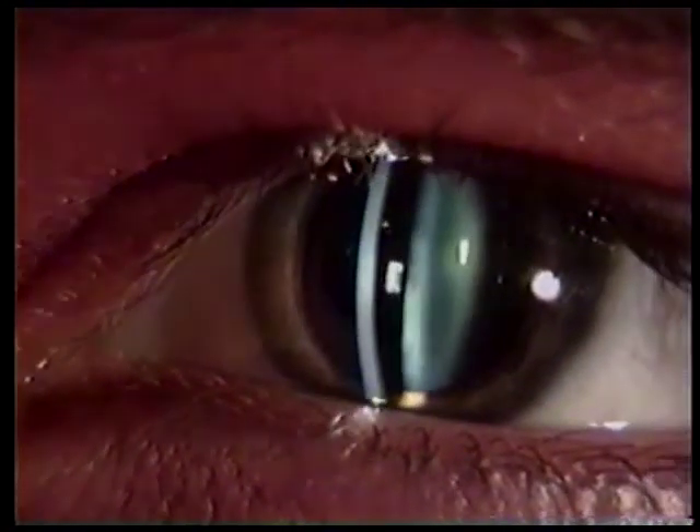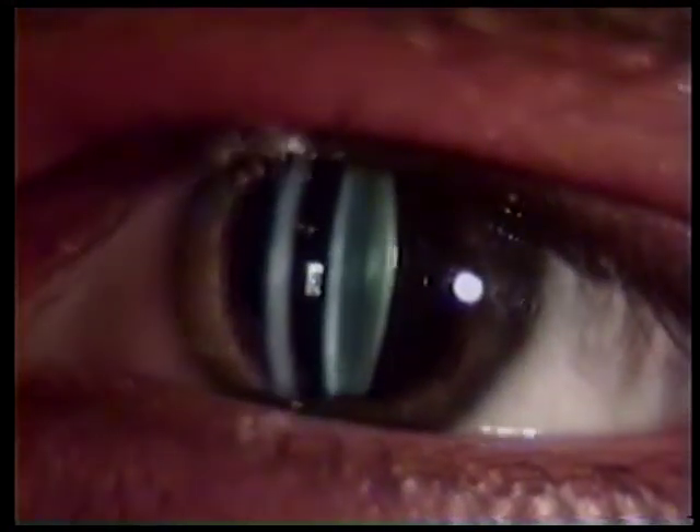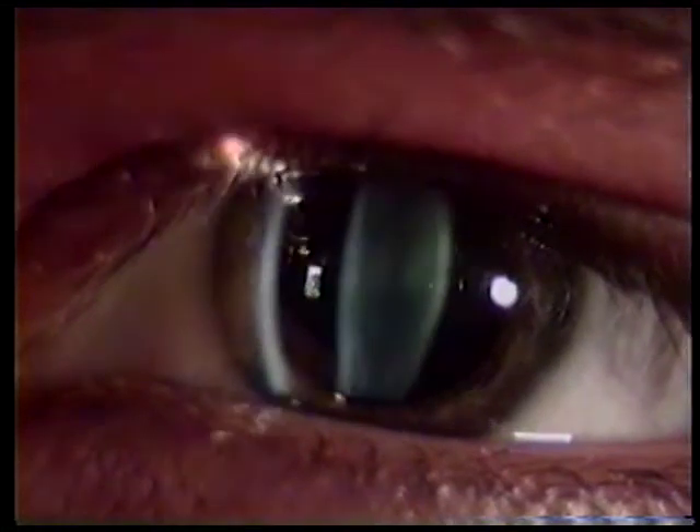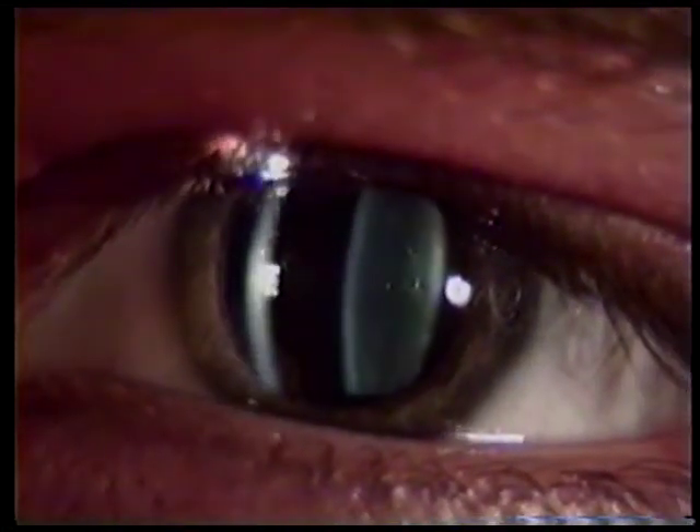This is called the Tyndall phenomenon. Remember, varying the angle between the microscope and slit illumination will enhance your observations. A wide angle between the light and microscope will produce an easily viewed optical section of transparent structures and will also highlight the texture of the iris. A small angle or coaxial position of the light will promote examining the details of clear structures by retroilluminating them.